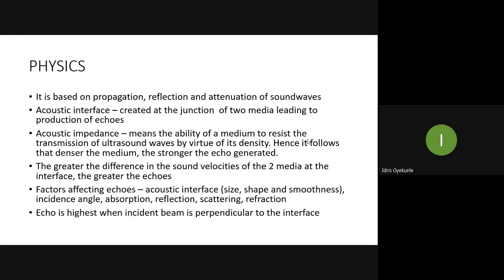So the physics of the use of ultrasound is based on the fact that sound waves are propagated mostly as longitudinal waves, as we see in light rays, and also can be reflected, and there's also an attenuation of sound waves.